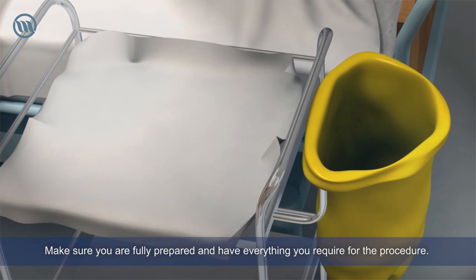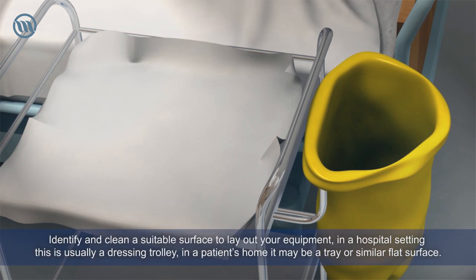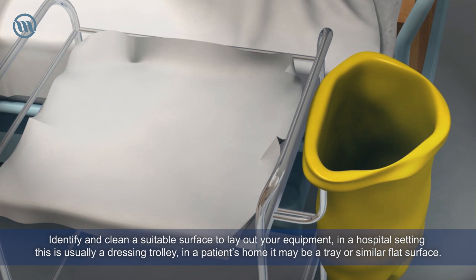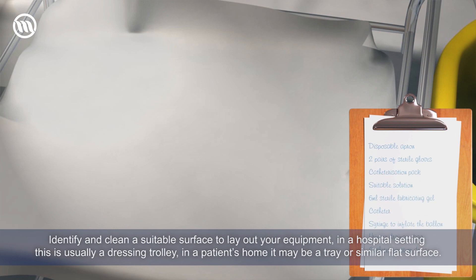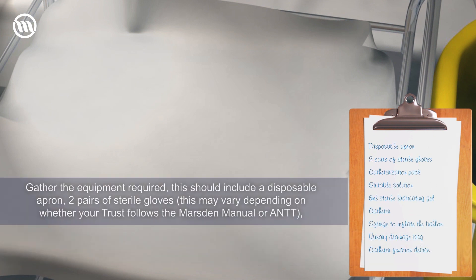Make sure you are fully prepared and have everything you require for the procedure. Identify and clean a suitable surface to lay out your equipment. In a hospital setting, this is usually a dressing trolley. In a patient's home, it may be a tray or similar flat surface. Gather the equipment required.